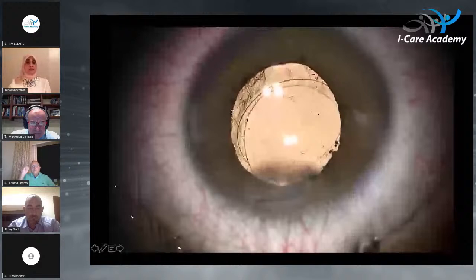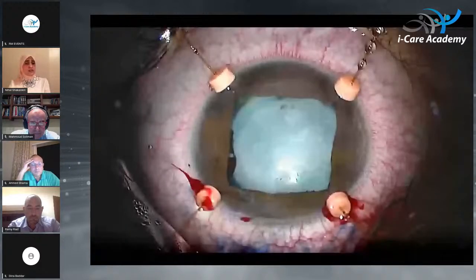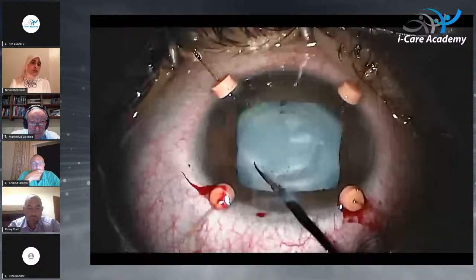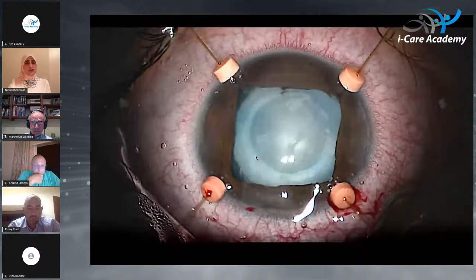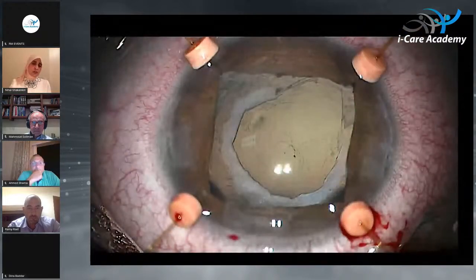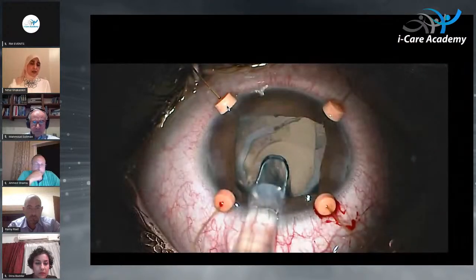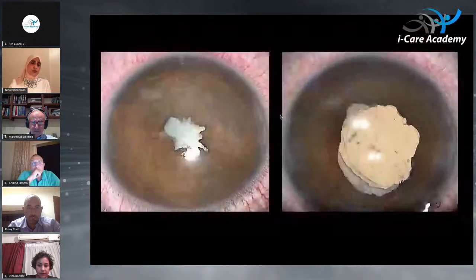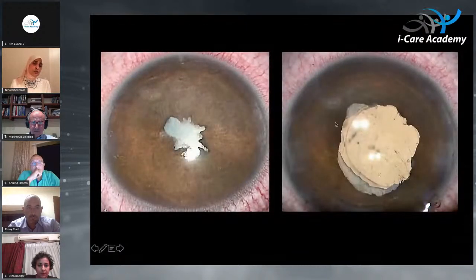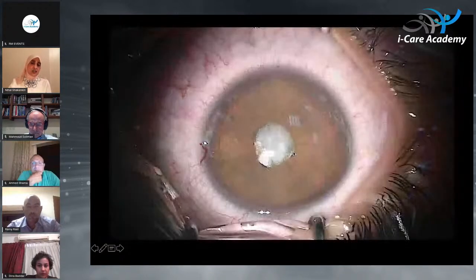However, we use iris retractors in these cases, and here, as you see, there is total fibrosis of the anterior capsule. In these cases, we have to go for the rexis with scissors, and here after irrigation aspiration, the posterior capsulorhexis, and it is possible to implant the intraocular lens, again a must, even if the anterior capsule is fibrotic like that, inside the capsular bag. And here at conclusion of surgery. This is before and at conclusion of surgery. And as I told you, the iris retractors make a sort of mechanical dilatation of the pupil.